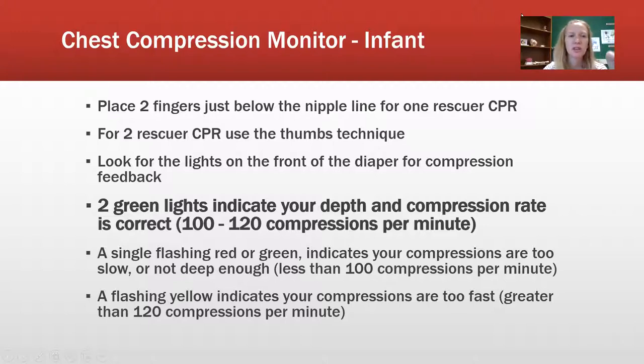For compressions on the infant, remember we use two fingers just below the nipple line for one-rescuer CPR. For two-rescuer CPR, you're going to use the thumb technique — I'll show both in this video. Look for the lights on the front of the diaper section for compression feedback. Again, you want two green lights indicating your depth and compression rate are correct at 100 to 120 compressions per minute.